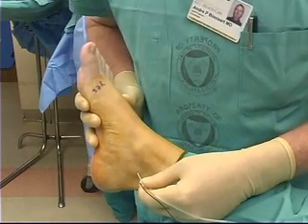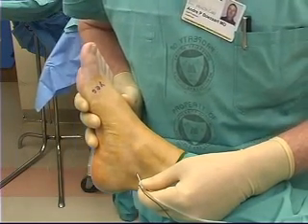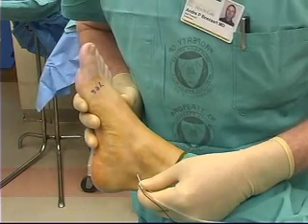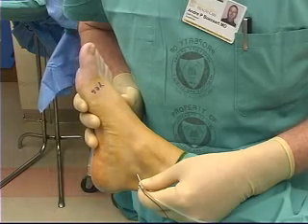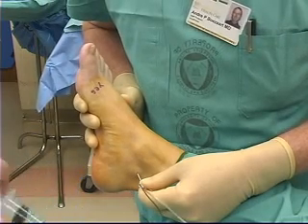A 22-gauge, 2-inch stimulating needle attached to a nerve stimulator set at a current output of 1 to 2 milliamps, 2 Hz, and a pulse width of 200 to 300 microseconds is used to locate the nerve. Toe flexion indicates that the nerve has been encountered.